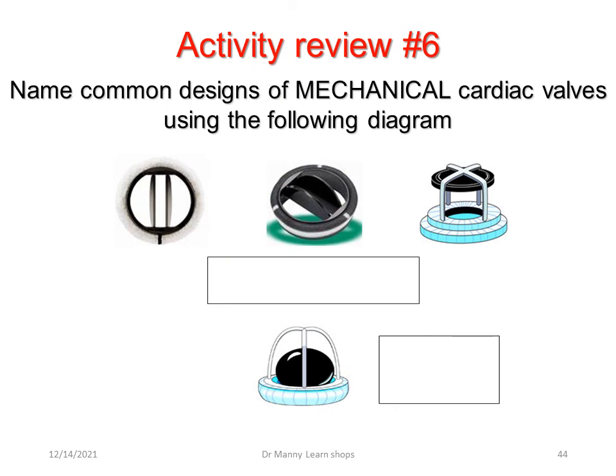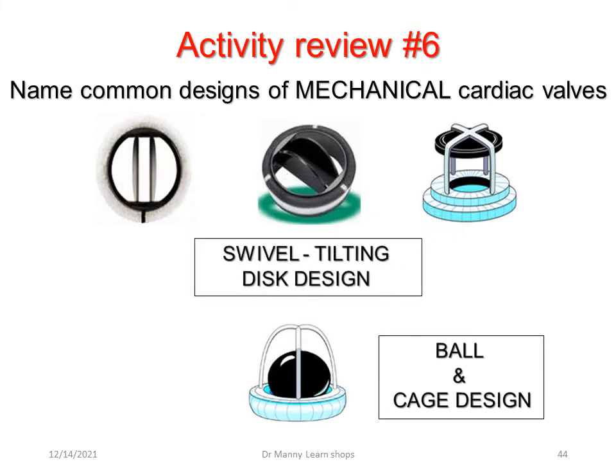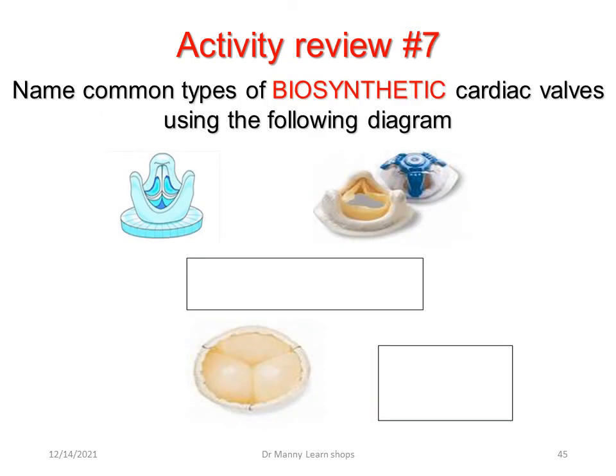Can you name common designs of mechanical cardiac valves using the following diagrams? Not the names of the valves, but the common designs. They are the swivel tilting disc design and the ball and cage design. What about the common types of biosynthetic cardiac valves using the following diagram?